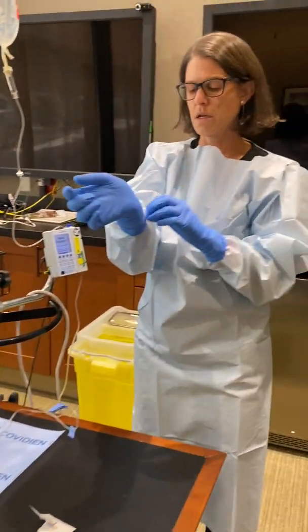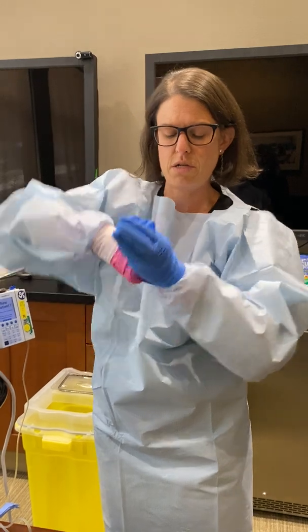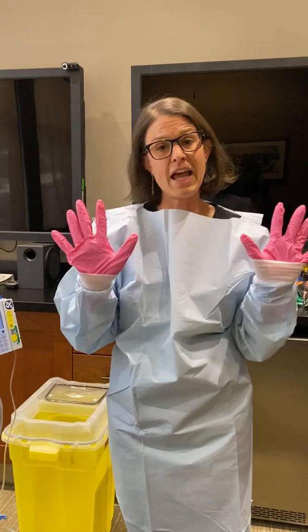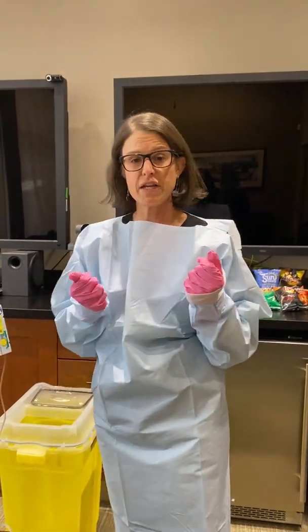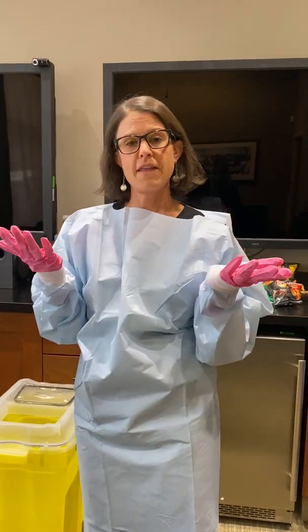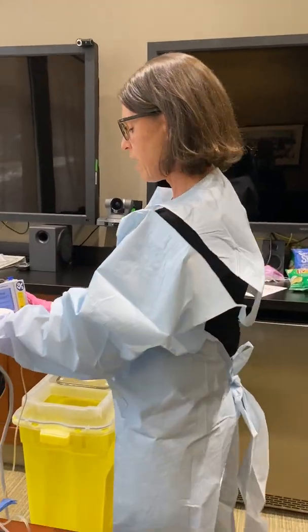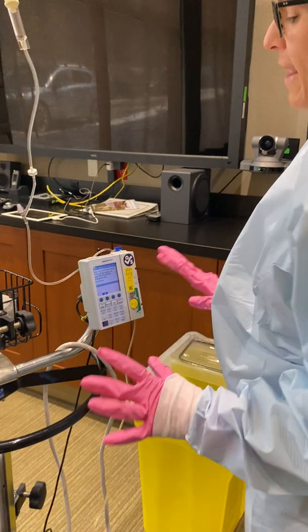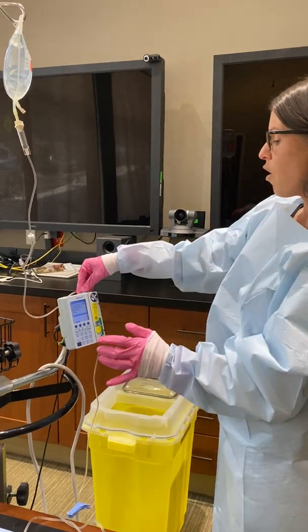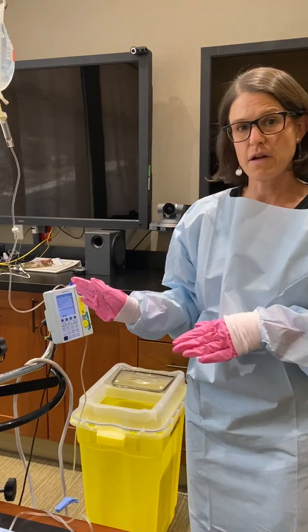At this point you would doff your first pair of gloves. Take those, put them in your yellow bucket, and now you can touch the pump. If someone is coming in behind you and also touching the settings on the pump and you have those blue gloves on, they can potentially get chemotherapy on their hands from touching the pump. So now I would go ahead and set the pump and leave it with my settings on here. The second person can come in, open all of the clamps, check the settings for the rate, and press start on the infusion.